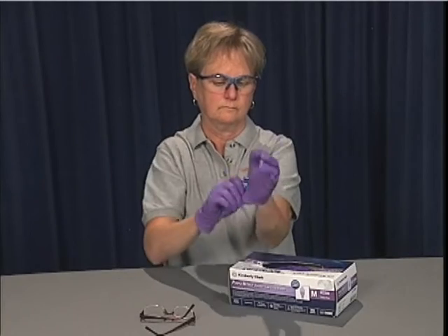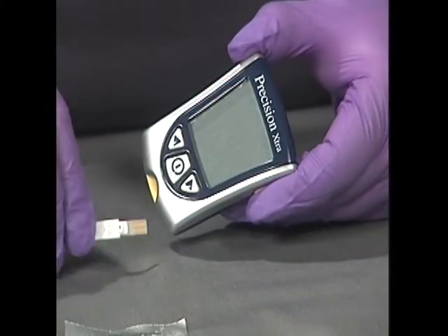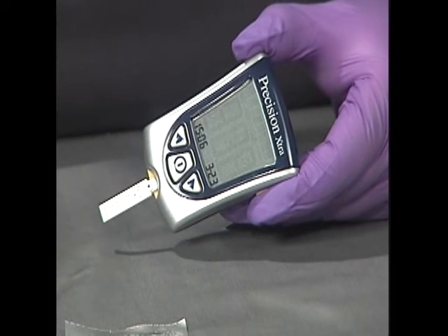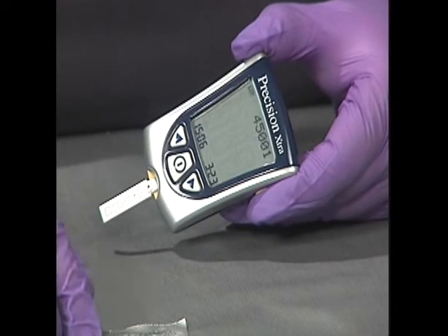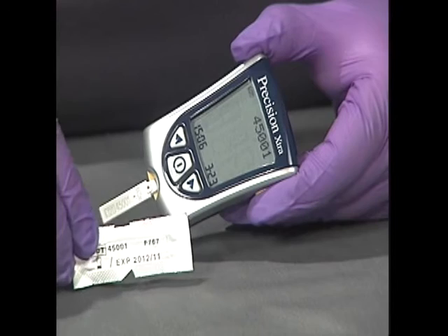Always use appropriate body substance isolation precautions. Make sure the unit is calibrated per the manufacturer's recommendations. Check the expiration dates on individual test strips and make sure the test strips have not been damaged or bent.